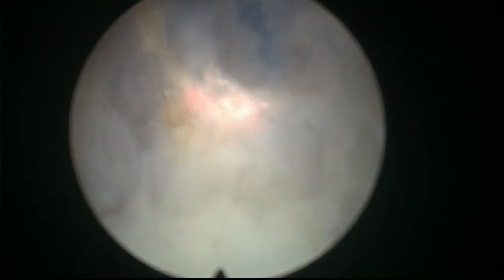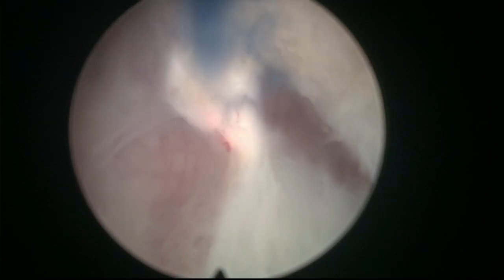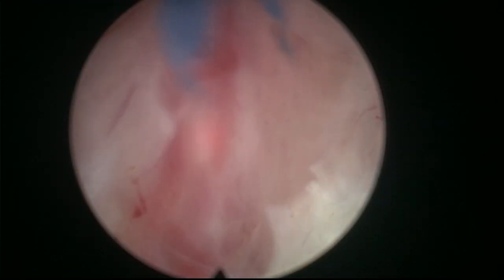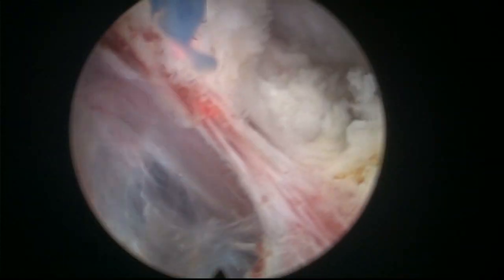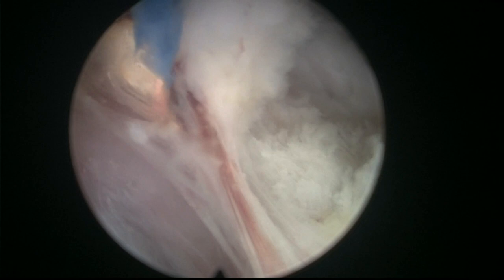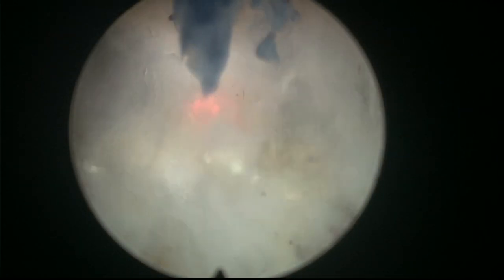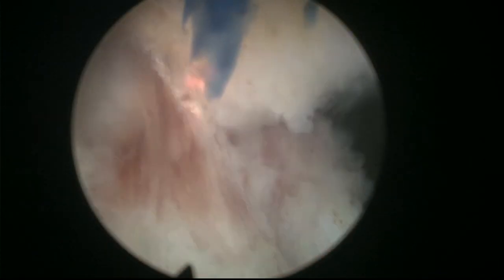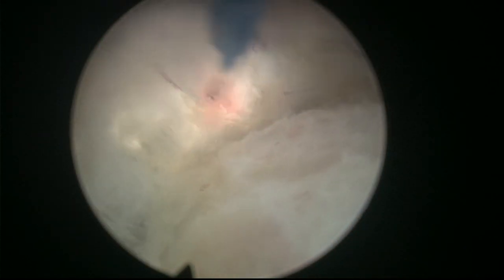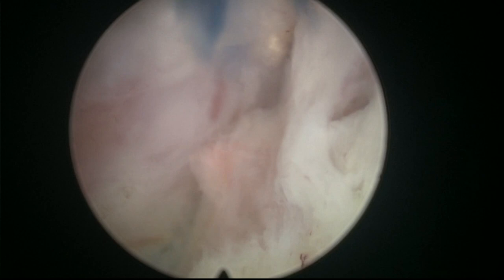It's better to carry a single perfect line of attack, a perfect plane, but sometimes you have to adapt to what you're finding. It's detaching very nicely with the energy. It's important to make good hemostasis as you go. I like to move the fiber from side to side so I don't allow it to stay too long in the same spot deepening the incision. This is the classic three-lobe technique, but we developed the apical plane and separated the sphincter from the apex before starting the dissection. In the classical technique, you dissect the lateral lobe and leave the apex for the end — that's why I think the apex suffers a little more, which might explain postoperative stress incontinence. We simply do not see postoperative stress incontinence, only very, very rarely.